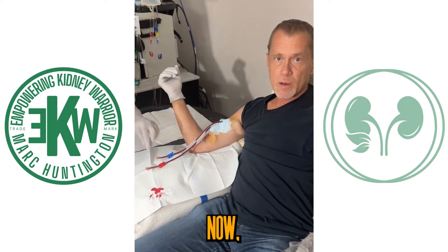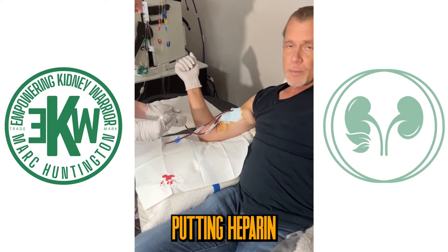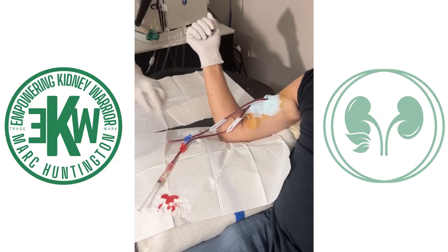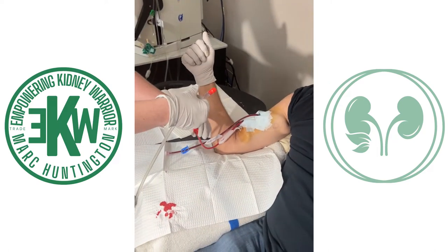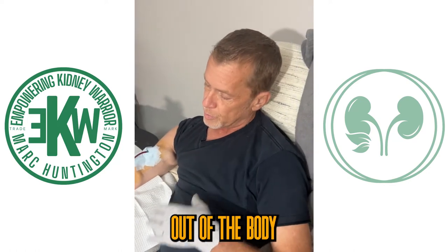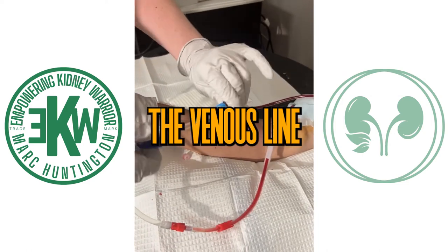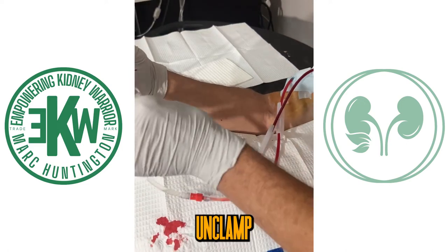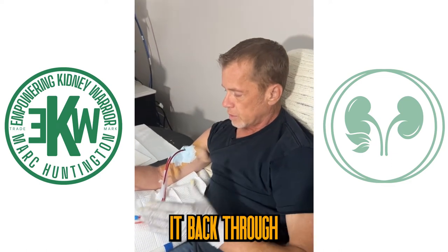Now, my beautiful wife and care partner Ashley is putting heparin in for the lines. Notice she backs it out just a little bit to make sure that there's no air again. Heparin keeps the blood running and makes sure that I don't get any clots. The red line is the arterial line — that's the line that pulls the blood out of the body and through the dialyzer. The venous line is what takes the clean blood after it runs through the dialyzer and pumps it back into my body.